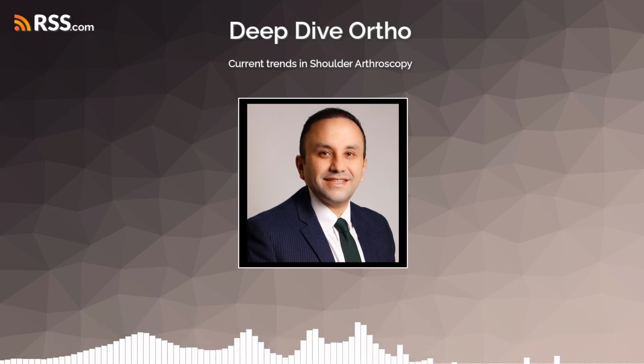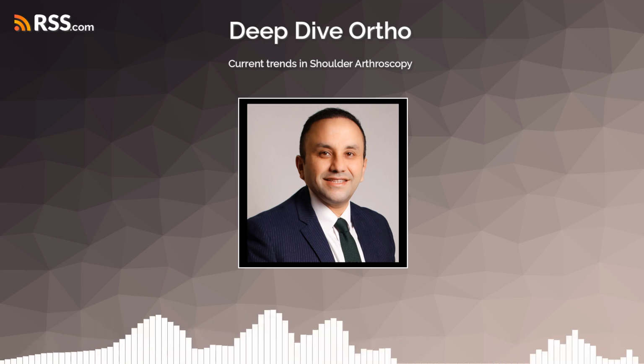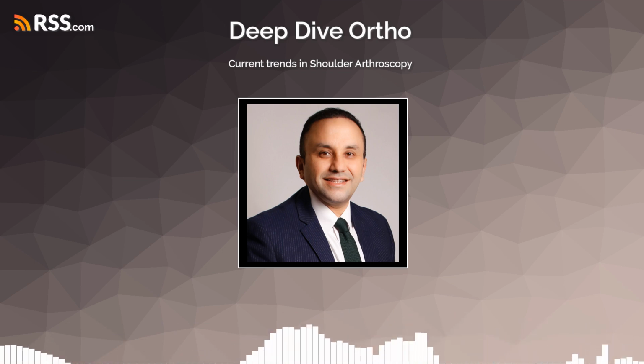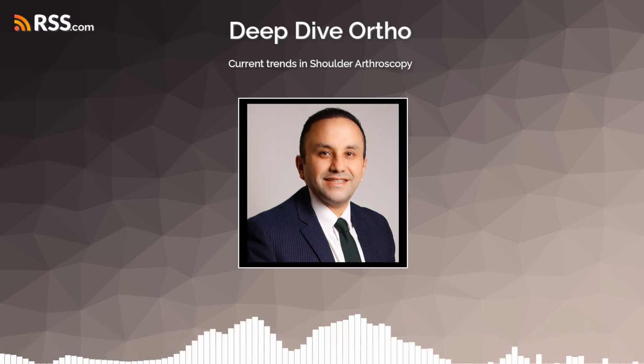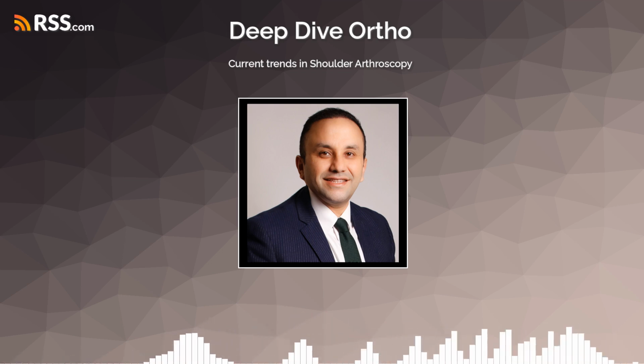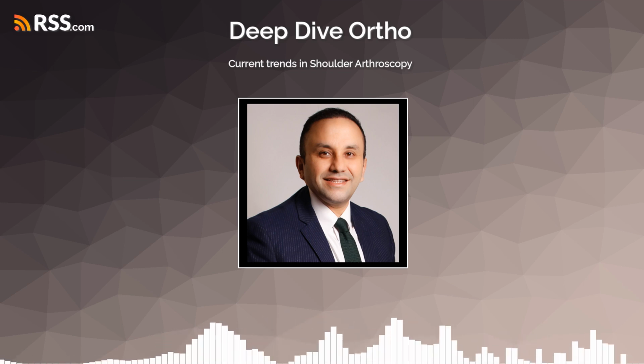Avascular necrosis of the humeral head, where the blood supply to the top of the arm bone is disrupted, is a serious condition. Can arthroscopy help there too? Arthroscopic-assisted core decompression and fibular strut grafting is a technique used to try and treat humeral head avascular necrosis, particularly in its earlier stages, before the head collapses.